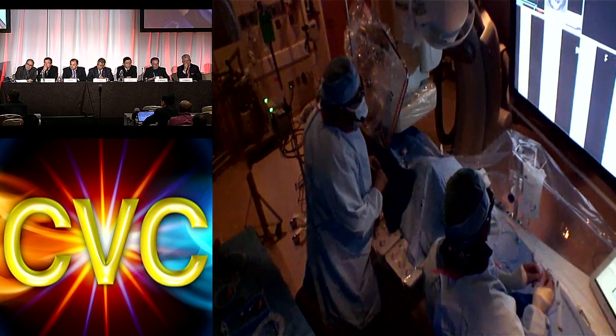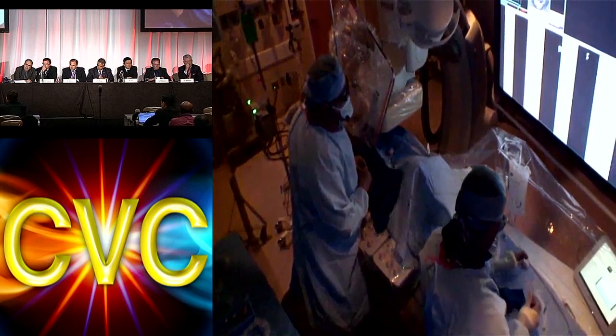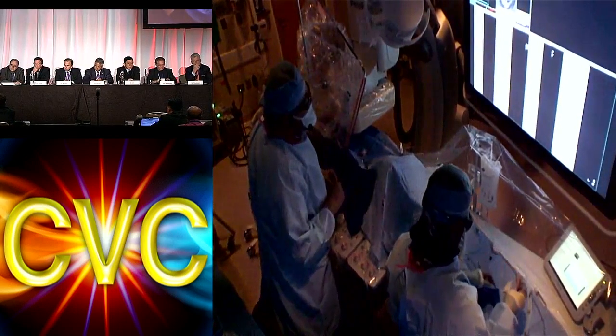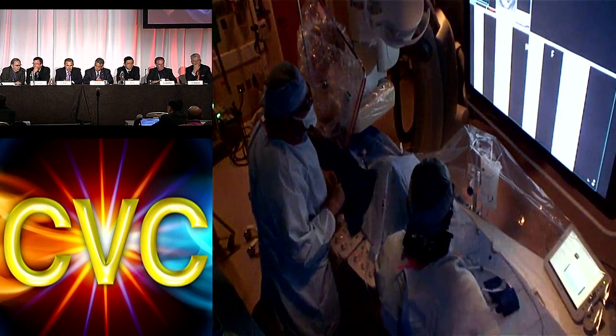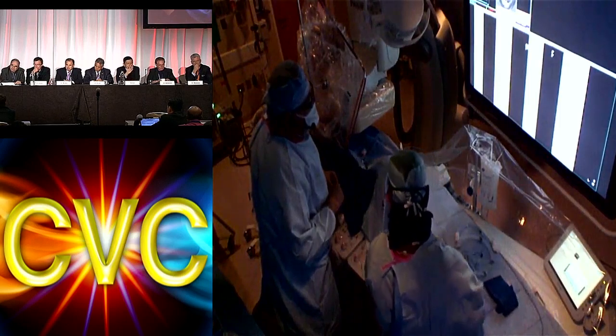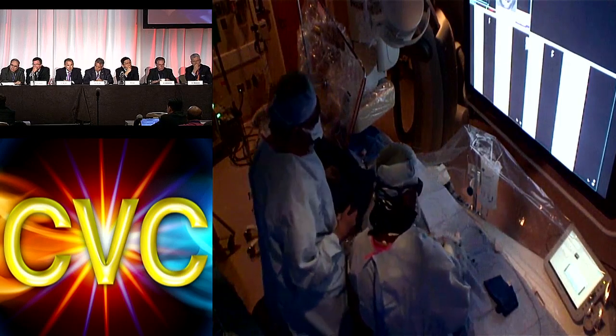I forgot to angio. Do you have a good segment of popliteal artery below the knee? Yeah. It went down the wrong one. You reconstitute prior to the trifurcation. It's small. Yeah, it's diseased. Let's get the torquer. We'll try once again.